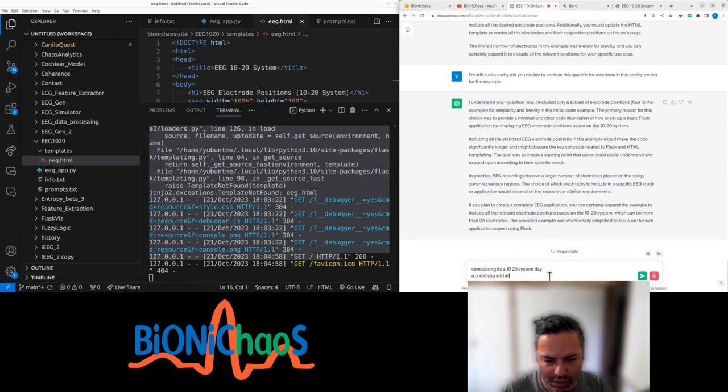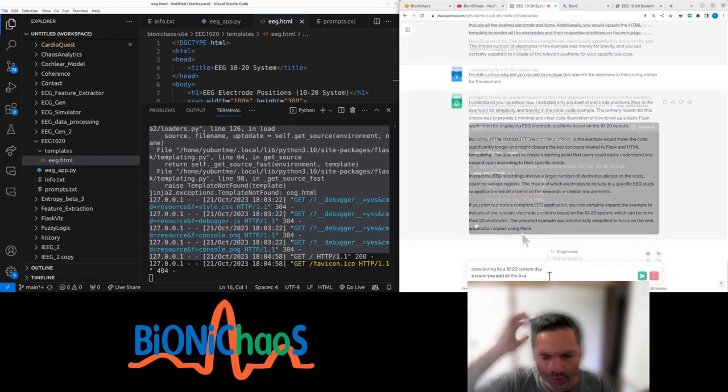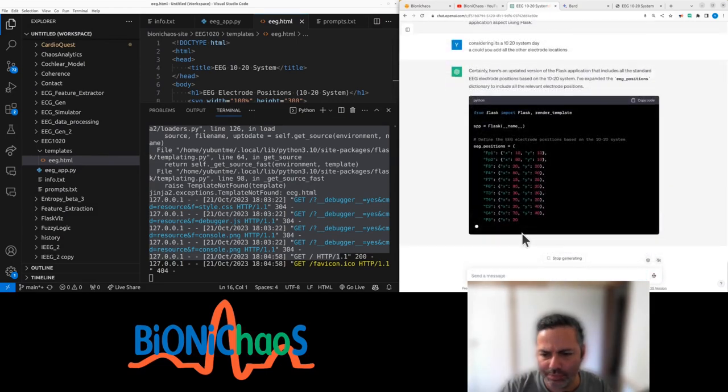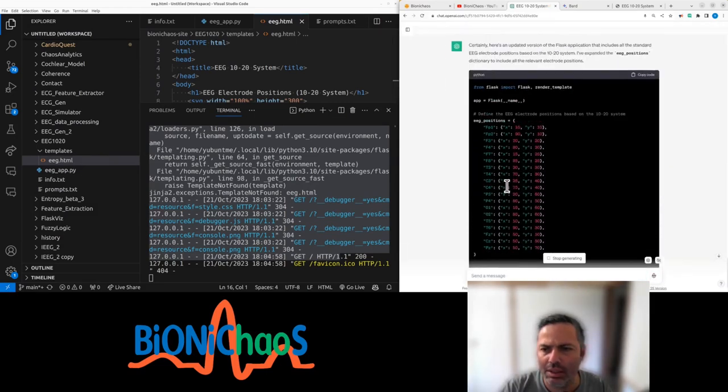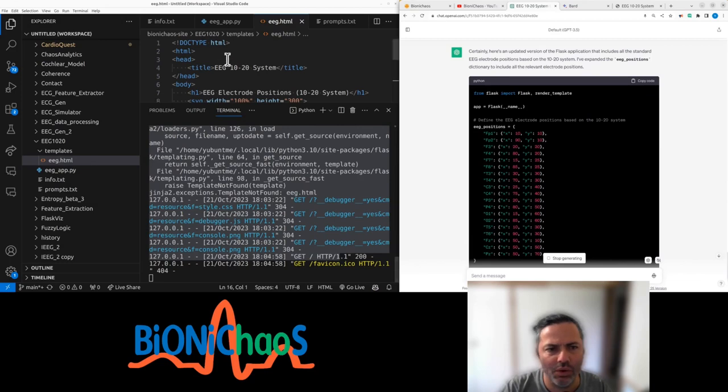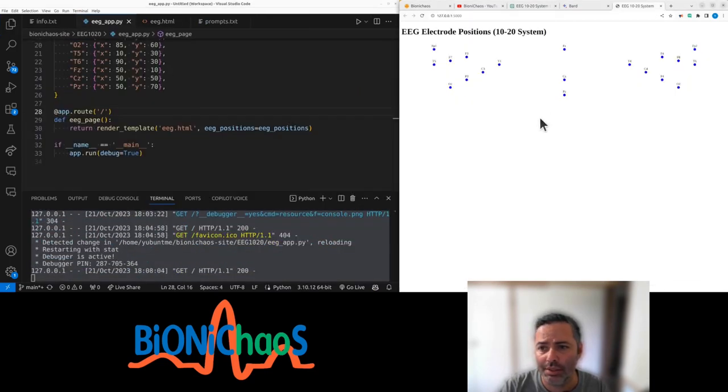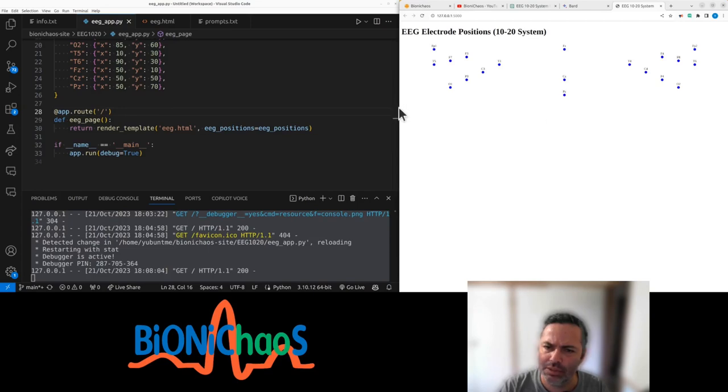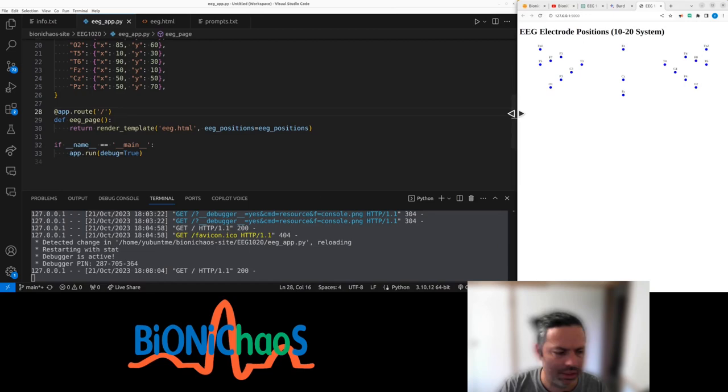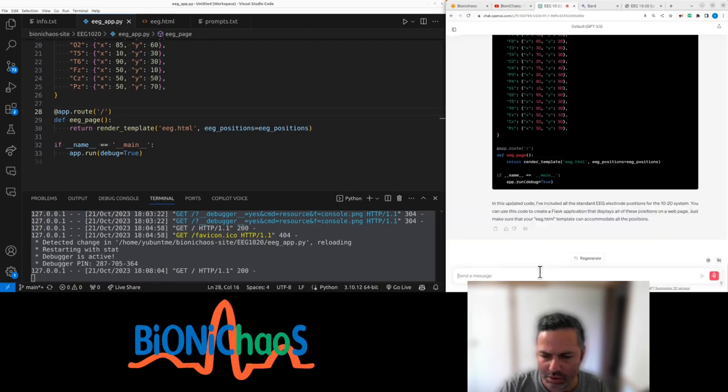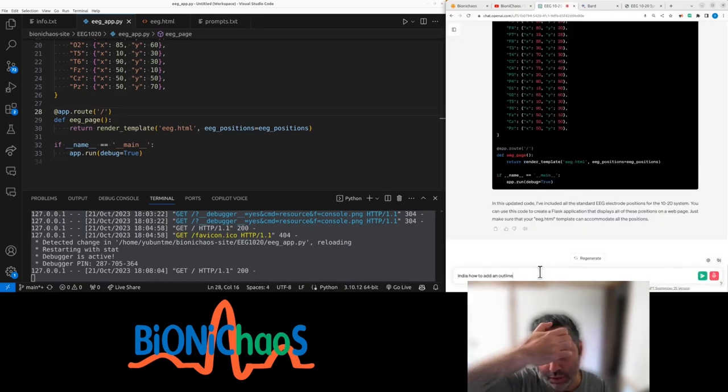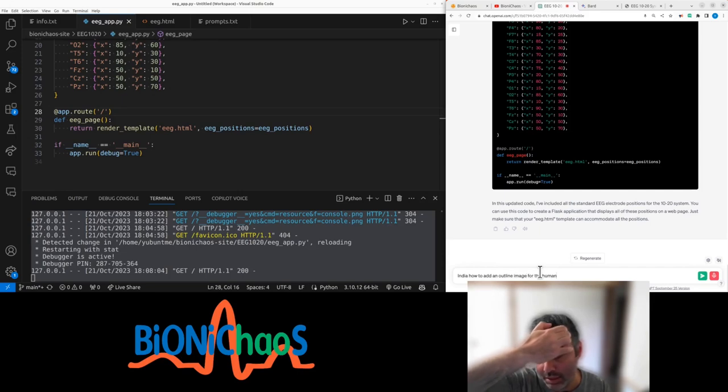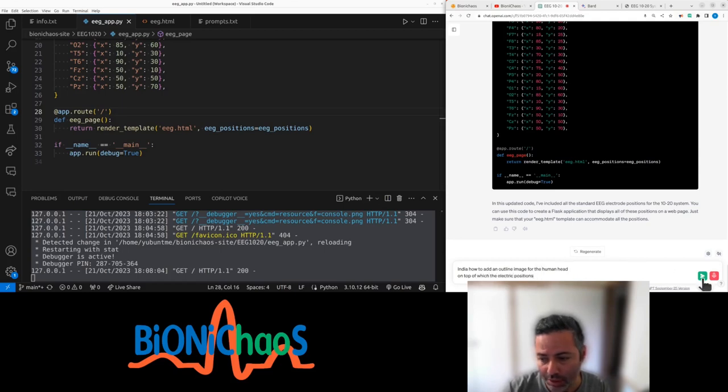Right, so that's adding all of them. Right, so weird, it don't look right. Any idea how to add an outline, the image for the human head, on top of which the electrode positions will be located?